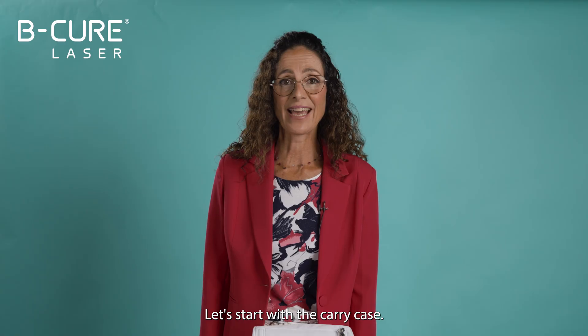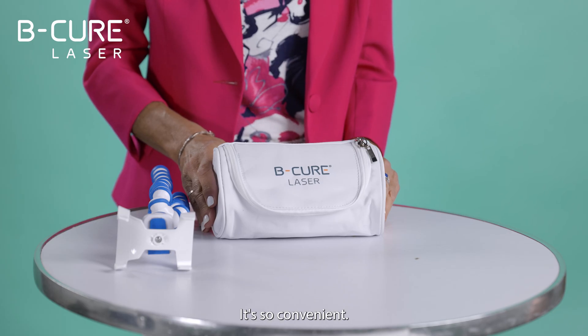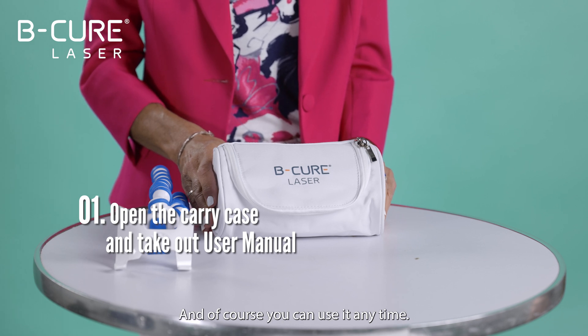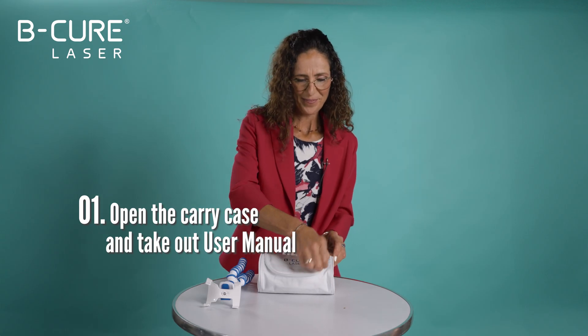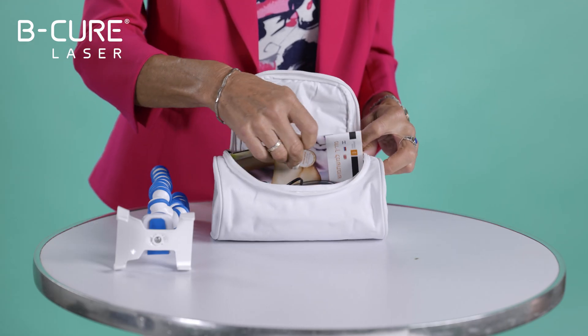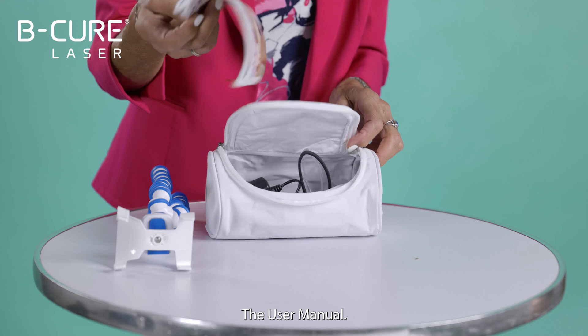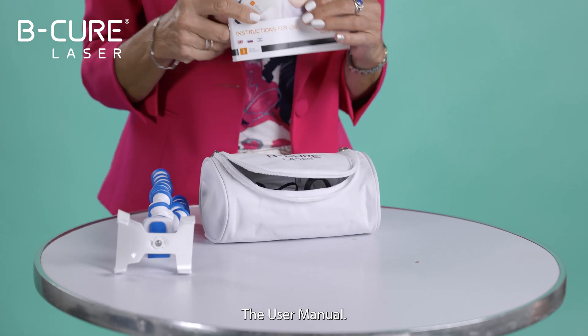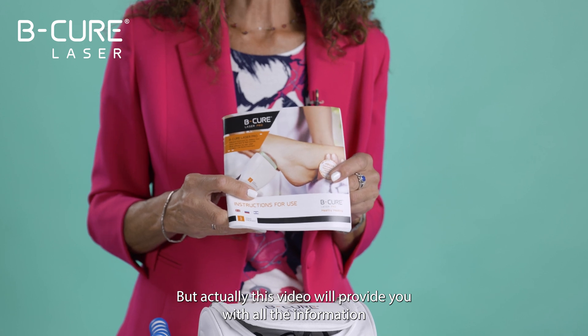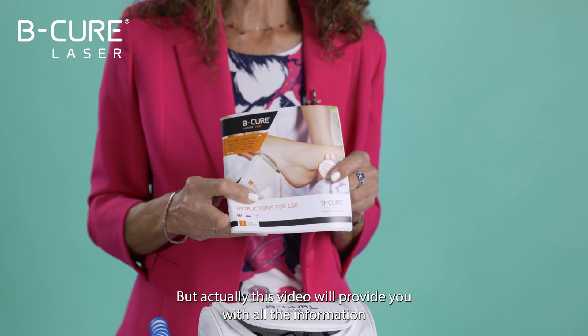Let's start with the carry case. It's so convenient — you can take it anywhere and of course you can use it anytime. The user manual is very important, but actually this video will provide you with all the information you'll need.